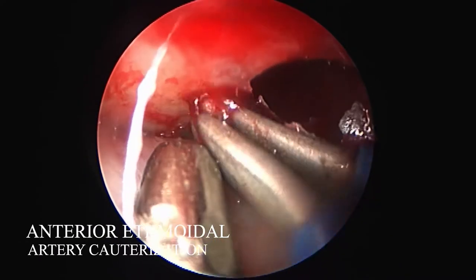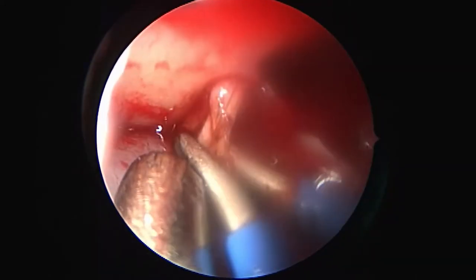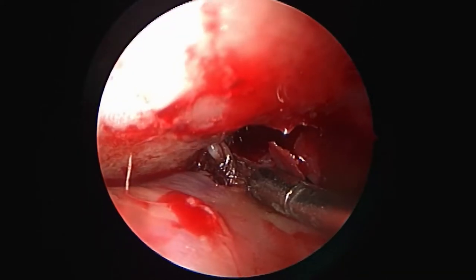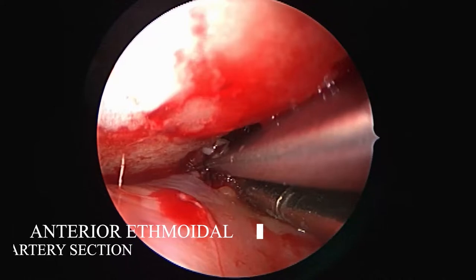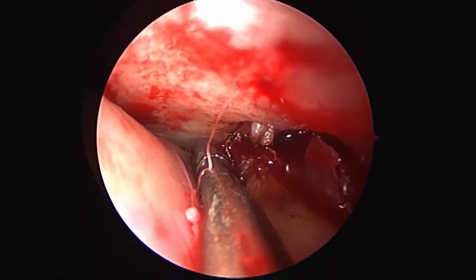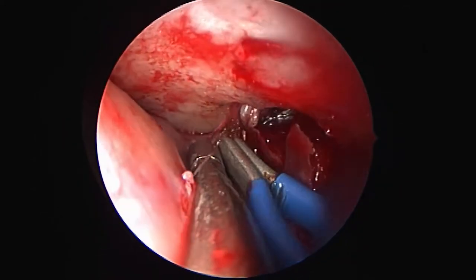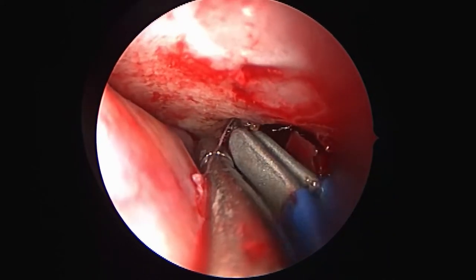We can now visualize the anterior ethmoidal artery between the lamina papyracea and the orbit. We cauterize it along its full length with bipolar electrocautery before cutting it with scissors. Cutting the anterior ethmoidal artery far from the medial wall prevents it from retracting into the nasal cavity and allows us to further cauterize it if arterial backflow bleeding occurs, as is the case here.